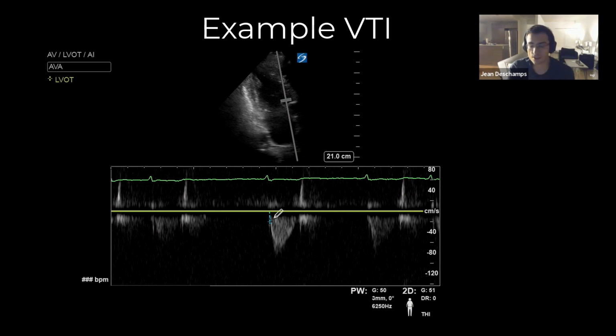The other thing that you notice is that you don't have that dip in the middle of darkness with a clean, thin envelope around it. That's probably because you're a little bit too close to your aortic valve and you're catching that kind of turbulence and acceleration that you would catch normally in a CW tracing. That tells me when I look at this tracing that I'm probably a little bit too close and I should get back. What you're looking for is the perfect balance between that narrow, very echogenic band around with the dark notch in the middle.